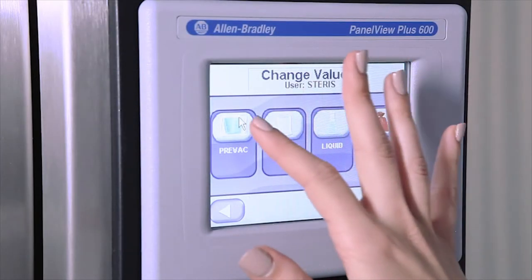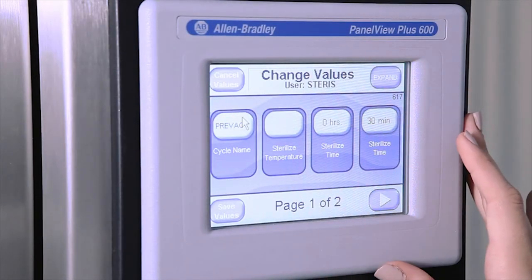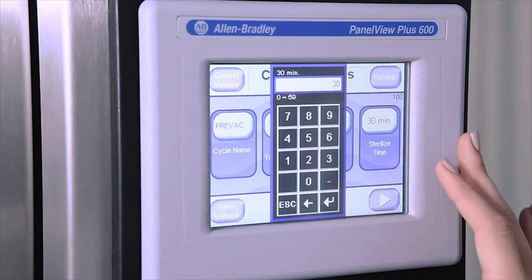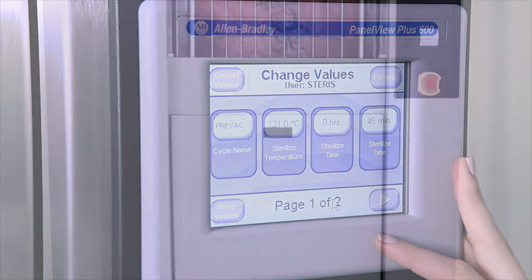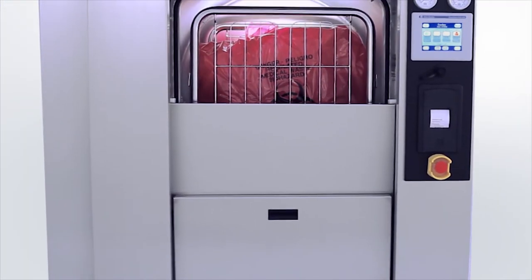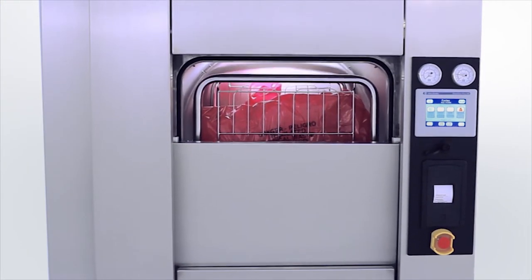All 430LS and 630LS sterilizers are provided with standard pre-vacuum, liquid and gravity factory preset and programmable cycles, as well as a cycle designed to efficiently process laboratory waste bags.